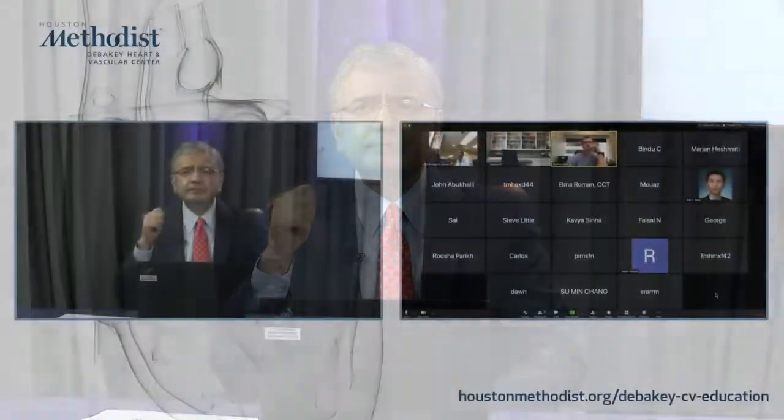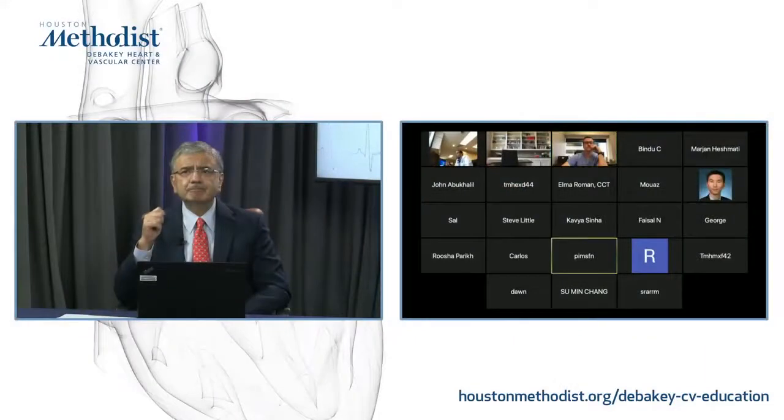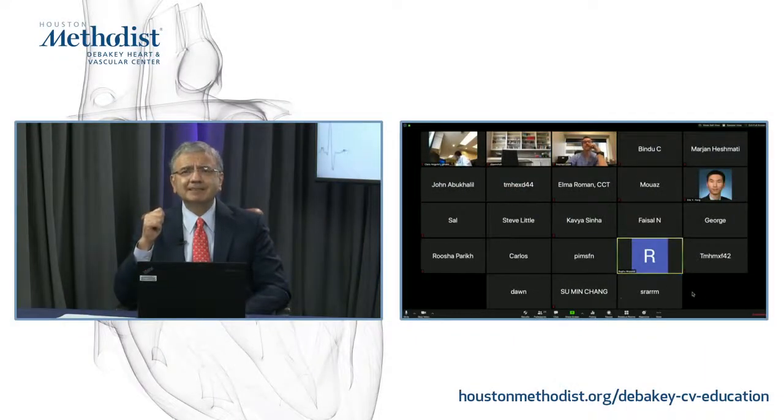Very good. Other questions? Dr. Zogby, this is Raghu Mupidi from Baytown. In terms of day-to-day use, contraindications-wise, if there are any shunts, especially a large right-to-left shunt, that's contraindicated. But what about a small PFO, a small bidirectional PFO? Would you still use it?